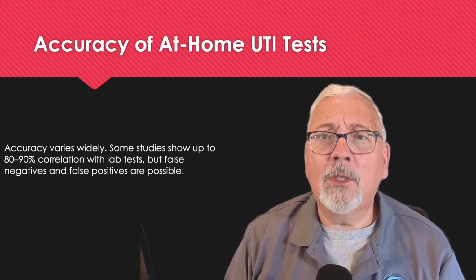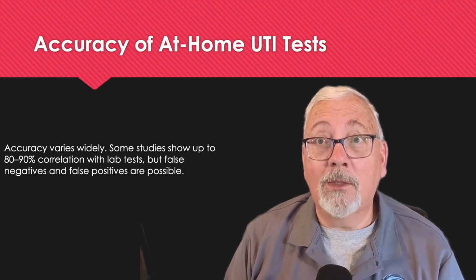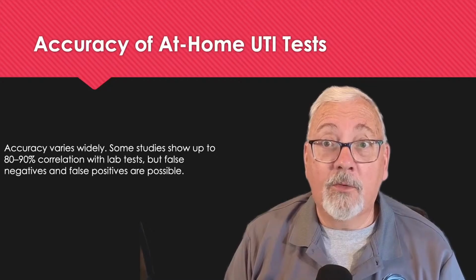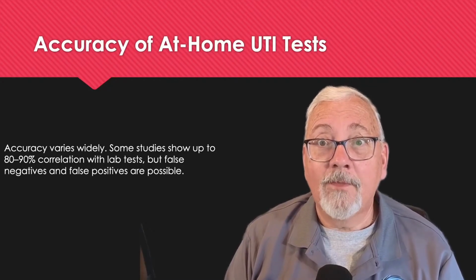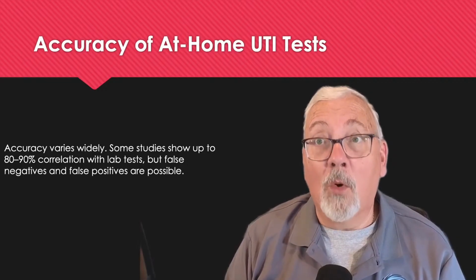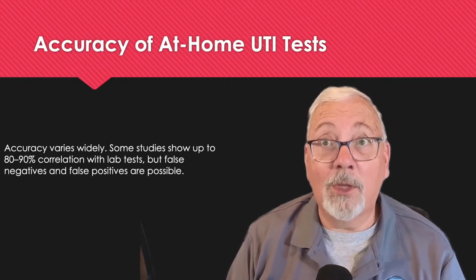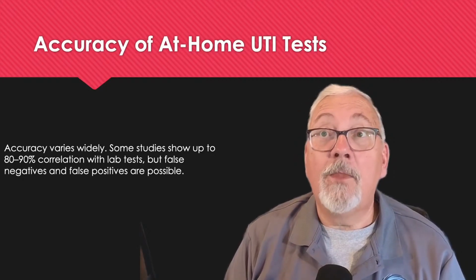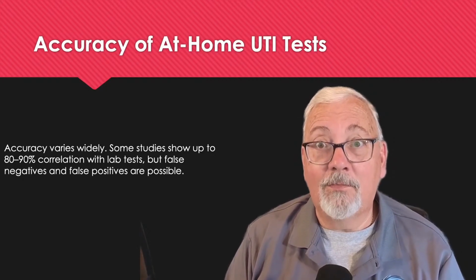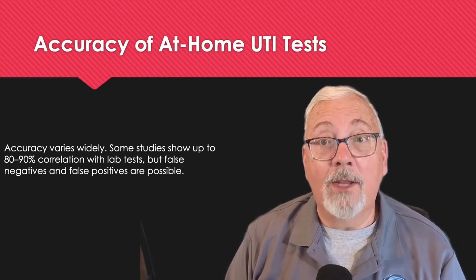And then leukocytes, well, that's the fancy name for white blood cells. White blood cells are how we break down or treat infections. So those are the things that are going in there and trying to gobble up those bacteria for you. So when you have an infection, typically you'll have more white cells present. And there's an enzyme from the white blood cells called leukocyte esterase, which we can test for with those test strips. And they may indicate an infection. However, once again, not all bacteria cause an increased white cell production. And it doesn't always show it early on, too.